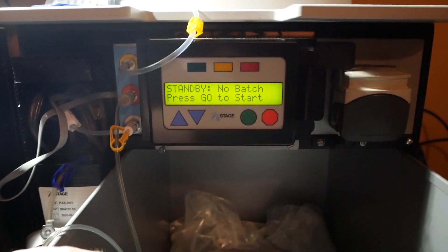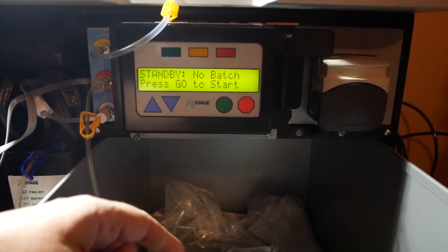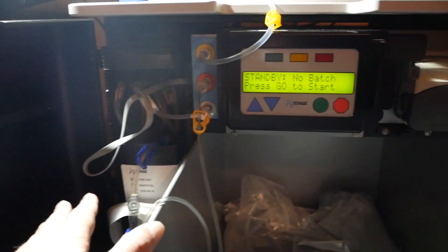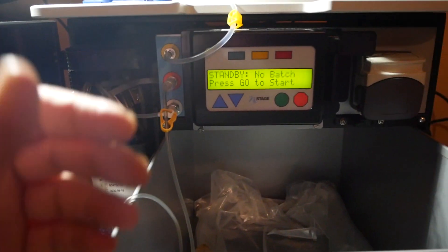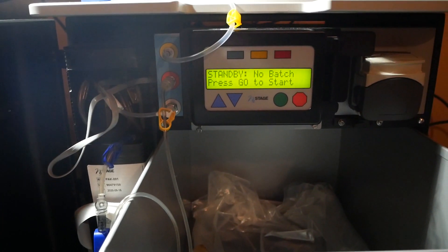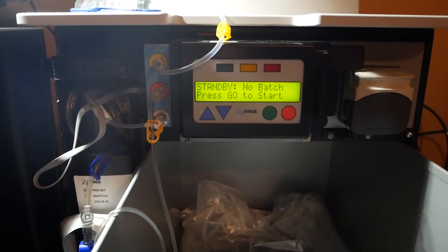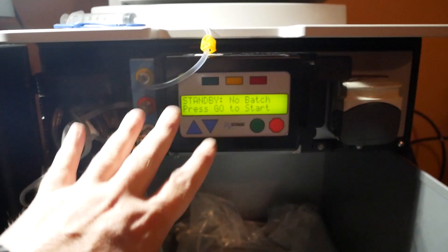Otherwise, until you're ready to make a batch, this is the step where you stop. You can unplug the machine and save power - there's nothing left in here, no liquids to worry about. The pack is self-sealed and contained, so it doesn't hurt anything to unplug the machine. If the background noise bothers you, you don't have to deal with it.